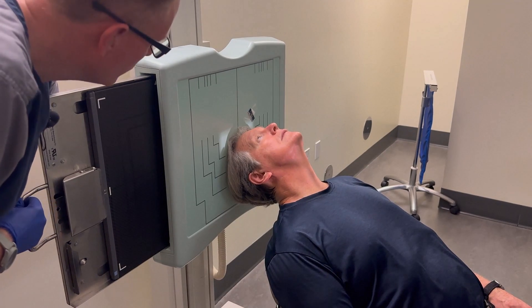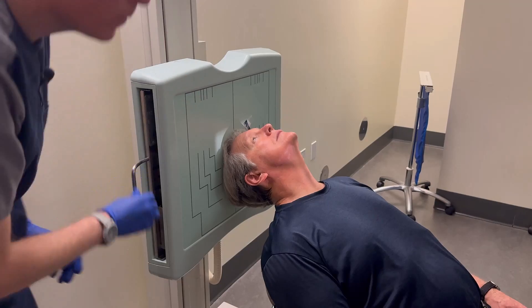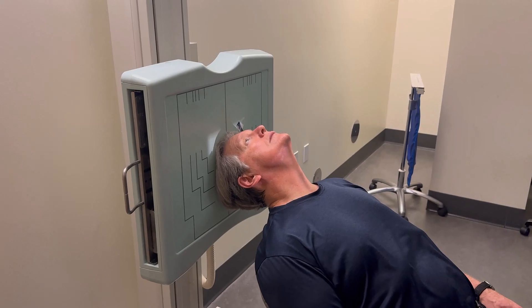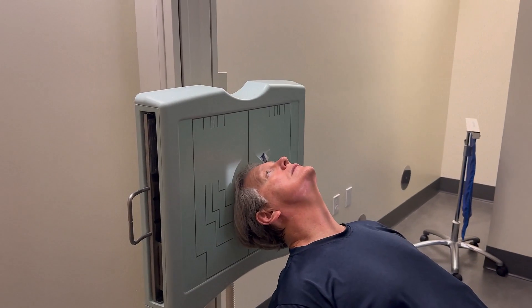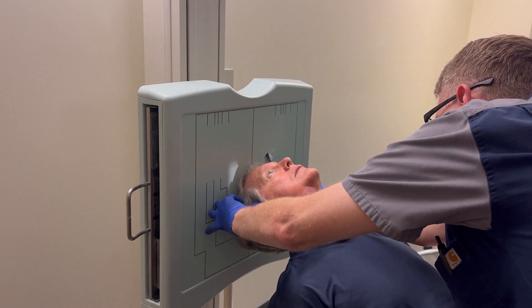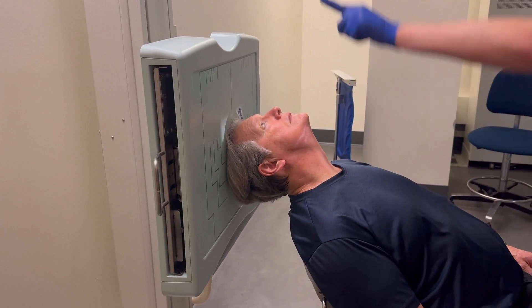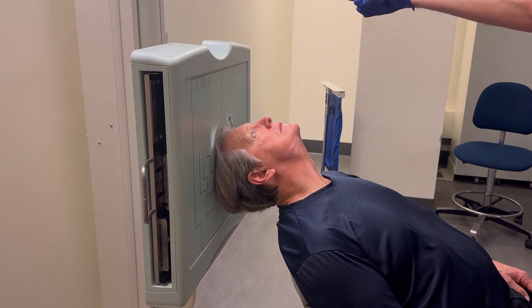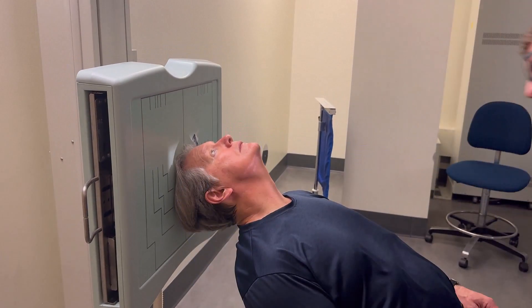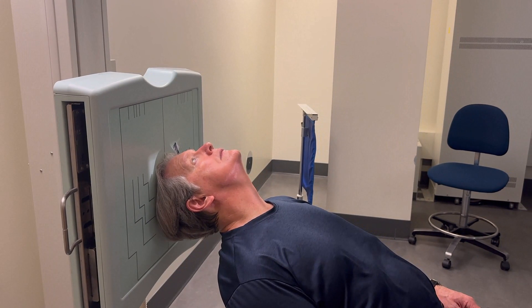Then I can just line up the bucky. I'm going to check for tilt and rotation — the patient's nose shadow should be coming straight up the vertical line on the bucky, and for tilt I'm just looking at the chin versus the top of the head. I need you to turn your head slightly. Stop — a little too far. Okay, this would be bilateral zygomatic arches.